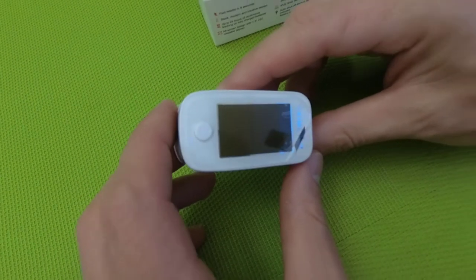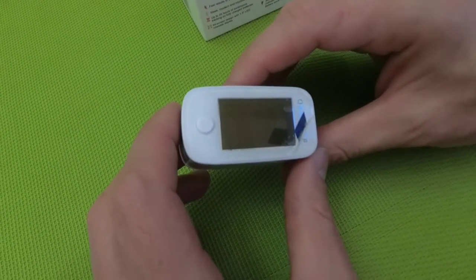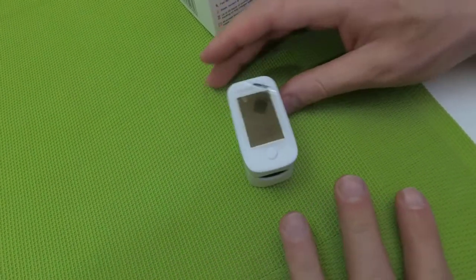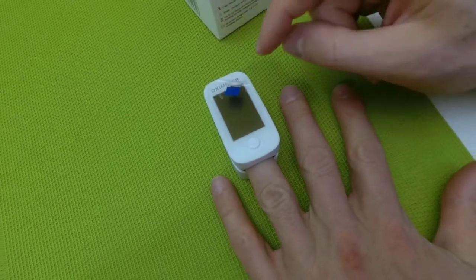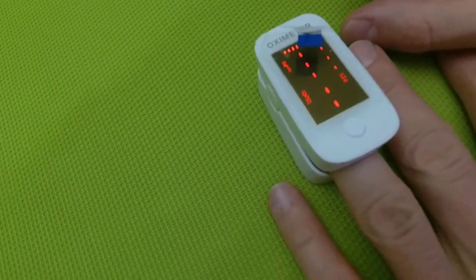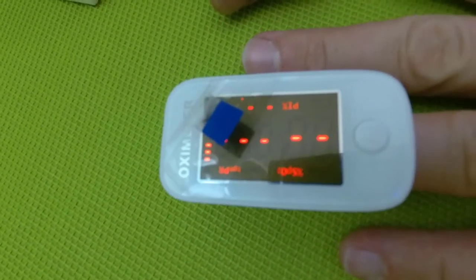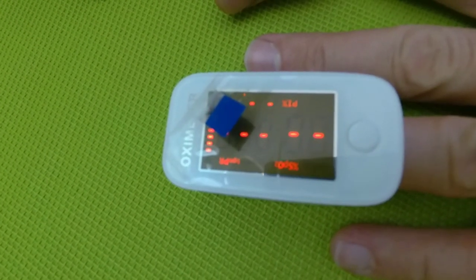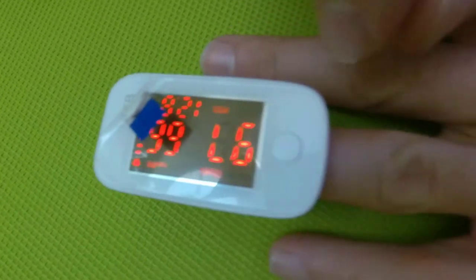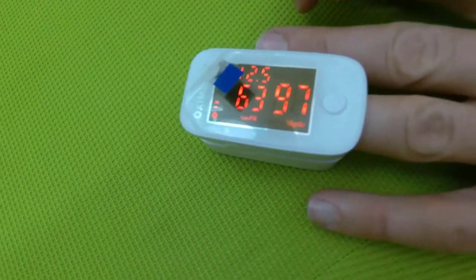So let's now try to measure my body parameters. For that I need to plug my finger in and press the button, then wait for a couple of seconds — about five to ten seconds — keeping my hand still. You need to rotate the measurements like this.